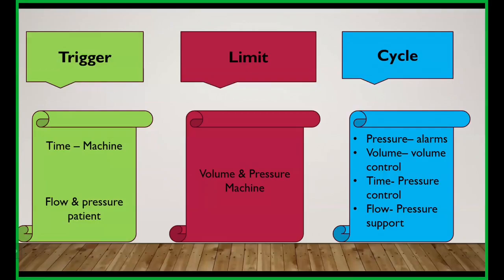The importance of flow cycle is that it avoids prolonged inhalation time, which is very important in neonatal ventilation. When the flow falls below the preset flow, that is less than 25% of the preset flow, then flow cycling happens and the prolonged inspiratory time will be reduced.